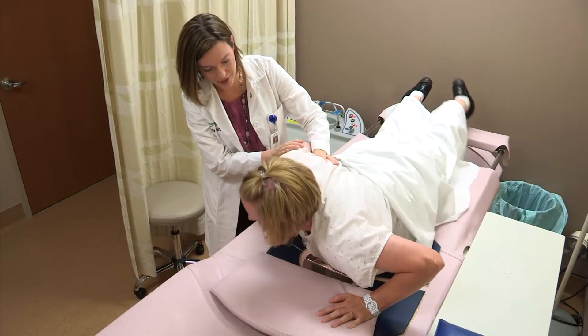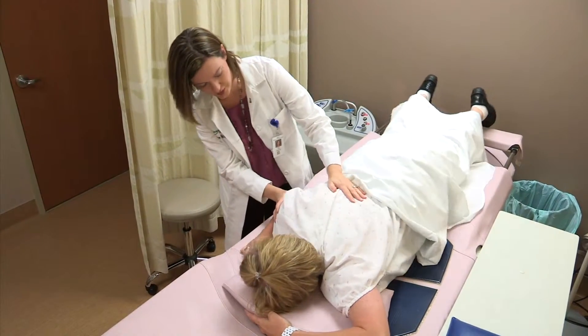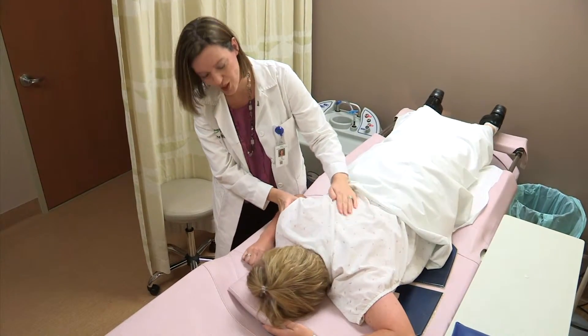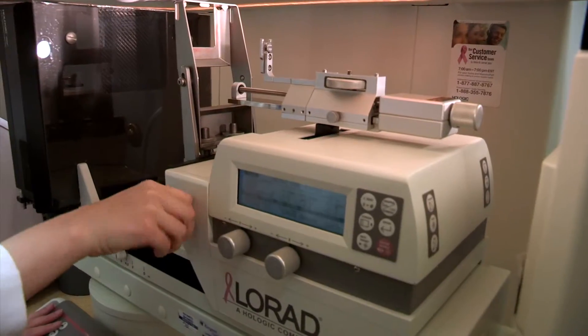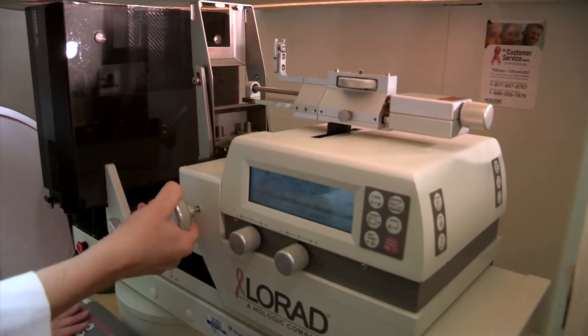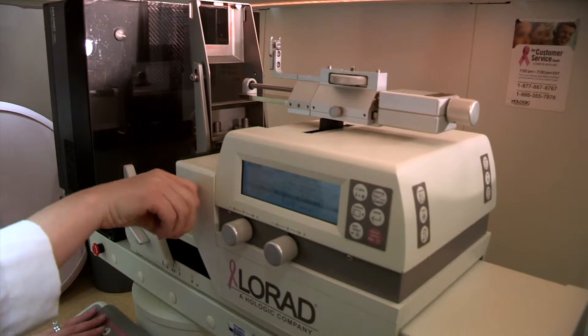For this procedure, you will be asked to uncover the breast. You will lie face down on the biopsy table, or possibly sit in the upright unit. Your breast will be numbed and then held in place while the biopsy is performed.